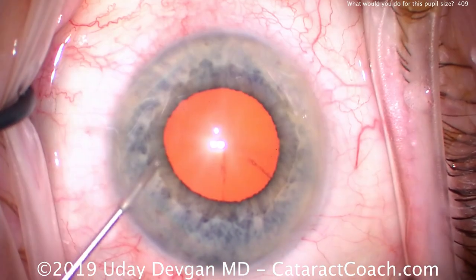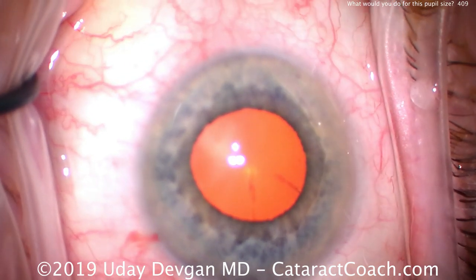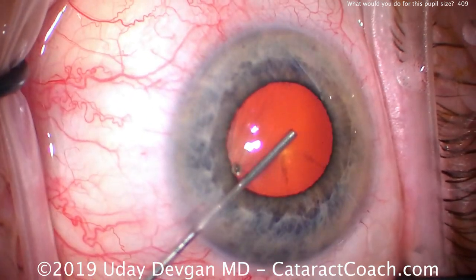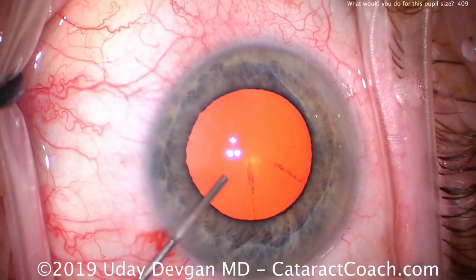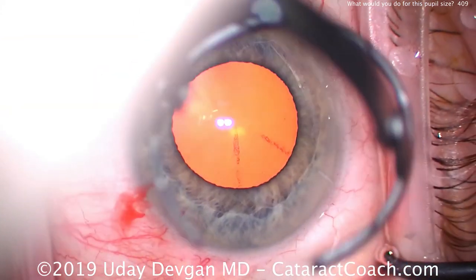Notice it goes under the tissue, so hopefully it'll have some effect there on the muscle. We're now going to use our dispersive viscoelastic and look how we inject it differently — we're doing the technique of viscomedriasis as popularized by Dr. Osher. And just with that alone we're able to expand the pupil, at least temporarily, to a little bit larger.